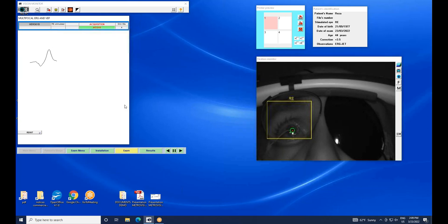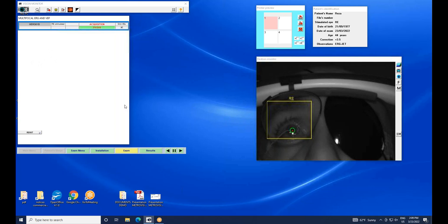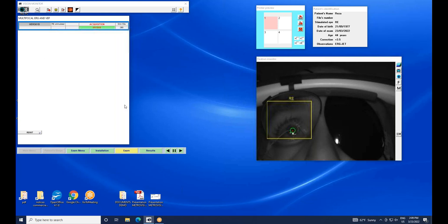On the video window, I visualize the pupil and the corneal reflex. The fixation of my subject is indicated by the position of the little red dot, actually the corneal reflection, in the center of the green circle, actually the pupil.